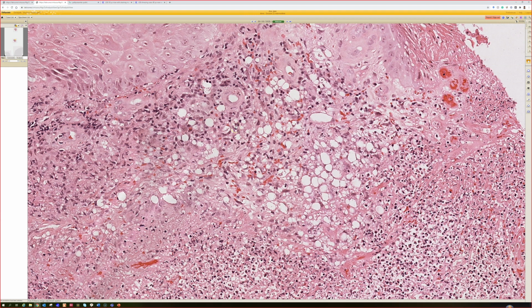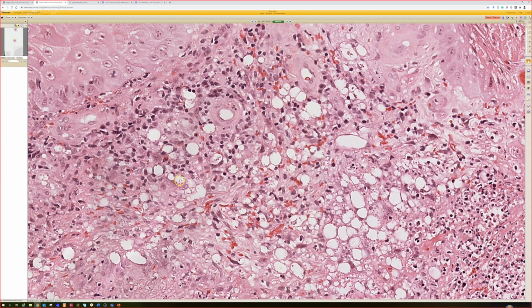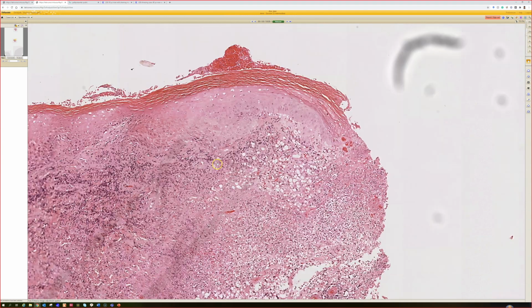And of course you can do culture. Histo will culture out, leash will not. You can look at the history, travel history, and where the person's from. There's antigen tests to test for histo that you can do, I think, on urine and maybe on blood. I'm not sure. So there's a variety of other ancillary techniques, but the main thing is when you see little holes with small round dots, histo and leishmaniasis. In this case it was leishmaniasis.